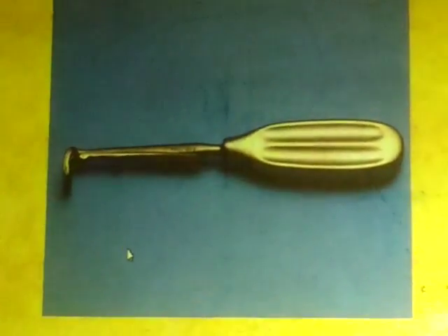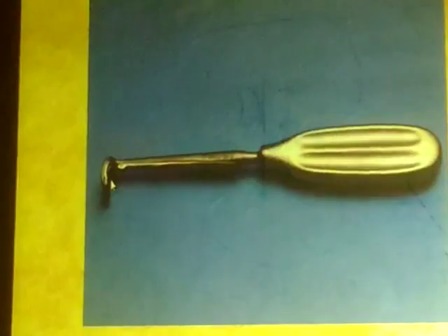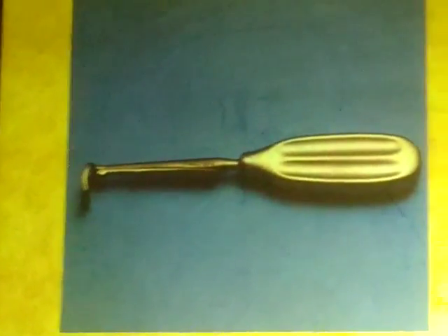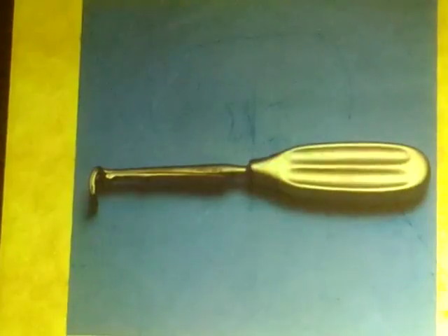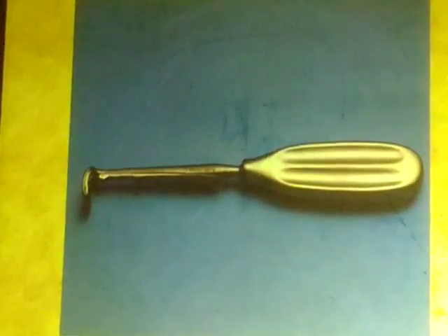Also, there is another type of curette that was popular sometimes. It's called the St. Clair Thompson curette, and this curette has teeth inside a cage. This curette was used in the past because at the early beginnings of doing the surgery, it was done under local anesthesia, or under general anesthesia with ether, without endotracheal intubation.